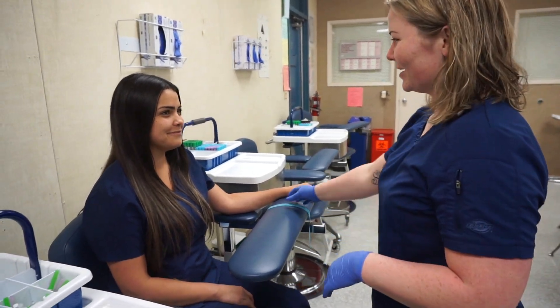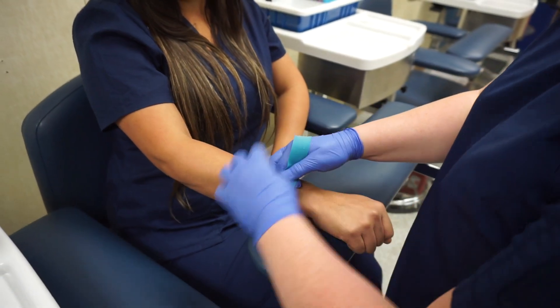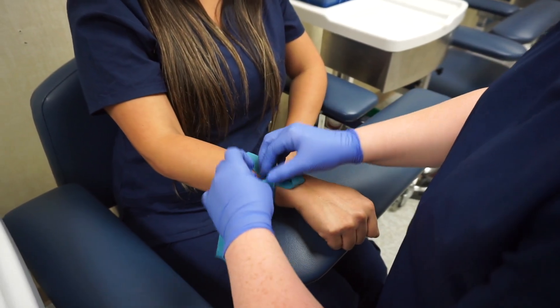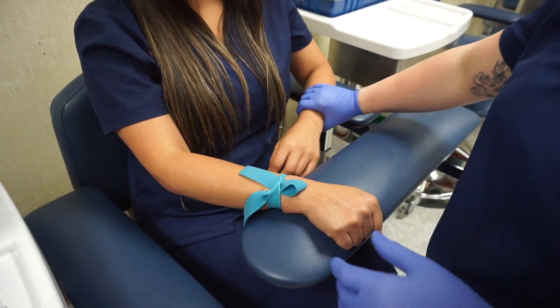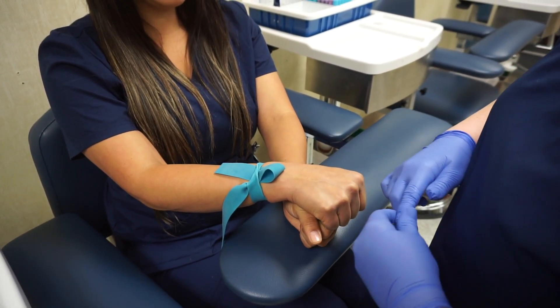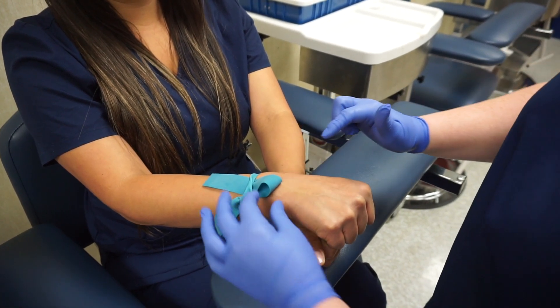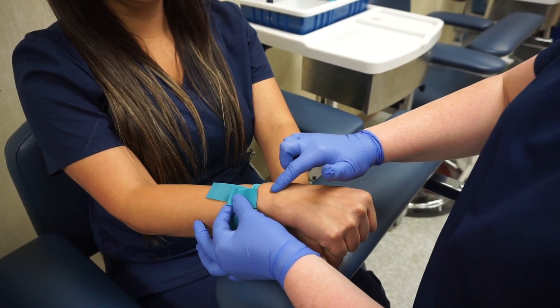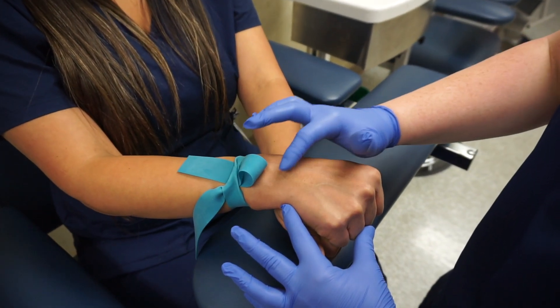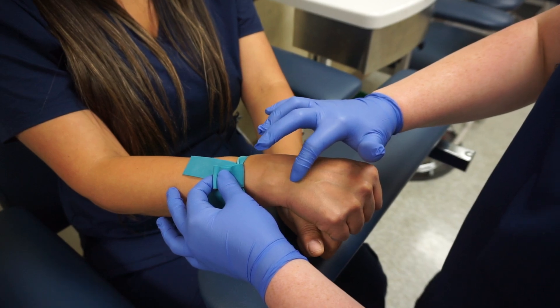Hi, my name is Brianna. I'm going to be taking your blood today. Is that okay with you? Yeah. Okay, perfect. So we're going to use your hand. Alright, so I'm going to tie the tourniquet here. Always ask the patient if it's comfortable or if it's too tight. Does that feel okay? Yes, that's fine. Okay, perfect. Can you put this other hand underneath for me? Sure. And then make a tight fist. So here I am palpating for a vein. You want to try to find a vein that's nice and squishy. This can take a minute or so.